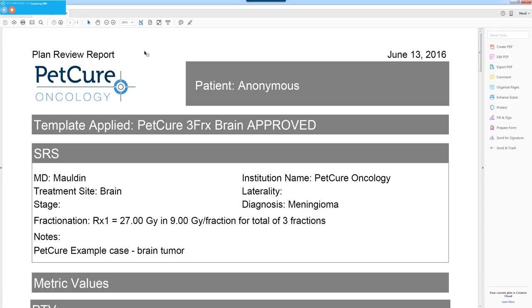So what Radiologica is, it's a software program that's used on the human side to apply metrics to different structures within a treatment field. So we can have metrics relating to the target itself, so we can be sure that we're giving the dose of radiation that we want to the target, and that we're meeting those critical dose steps that are important for inducing a remission or gaining some measure of control. And just as important, we can look at dose metrics to the normal structures and be sure that we're not pushing a target dose in a normal structure above where it should be.